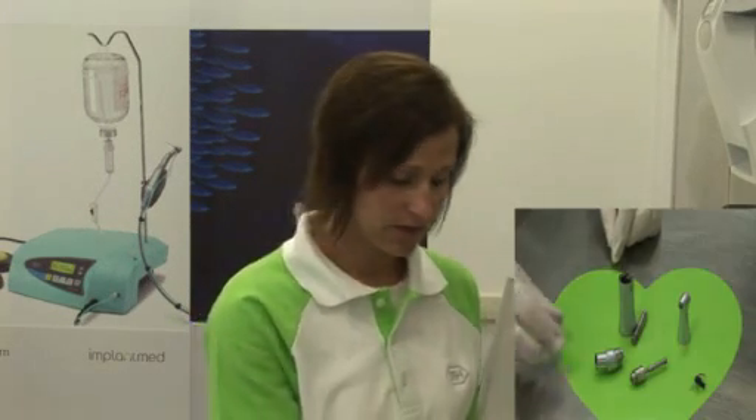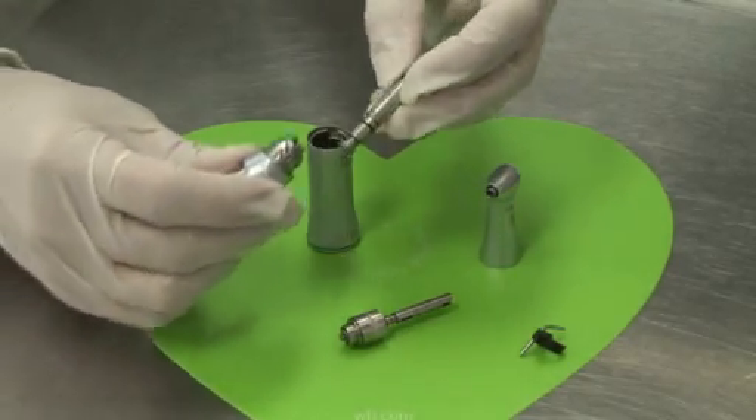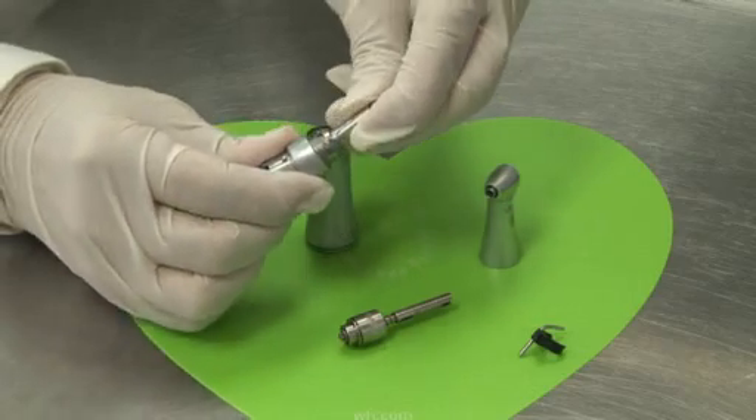To reassemble the cleaned and dried components, starting with the knee component and the middle gear assembly, take the pointy end of the gear assembly and place gently in.